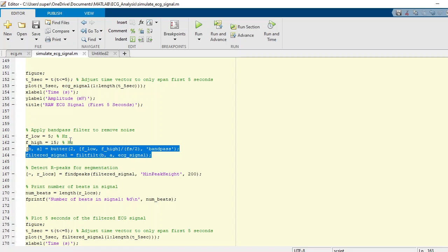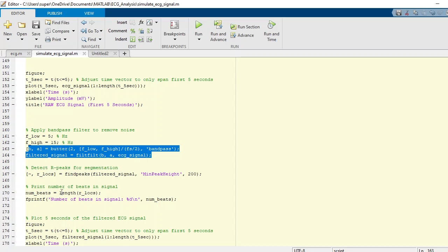What we can do next is we can detect the R-peaks. We can simply use a findpeaks function. Here is the findpeaks function. We input the filtered signals and minimum peak height of 200. It returns the r_locs variable. If we find the length of the r_locs, we will get the number of beats.